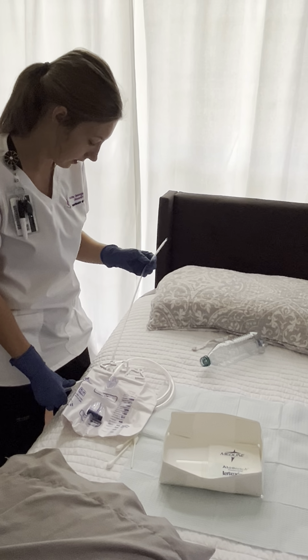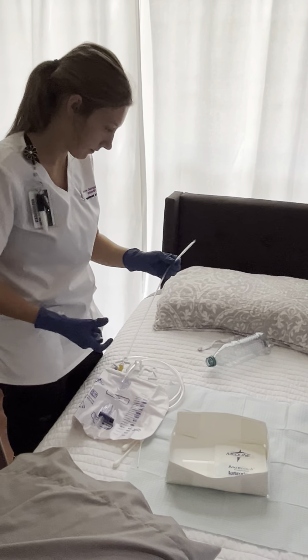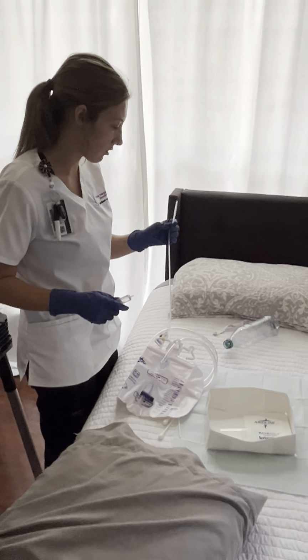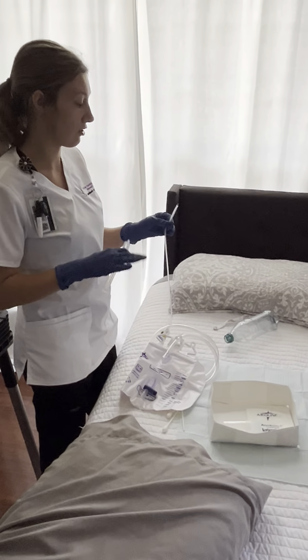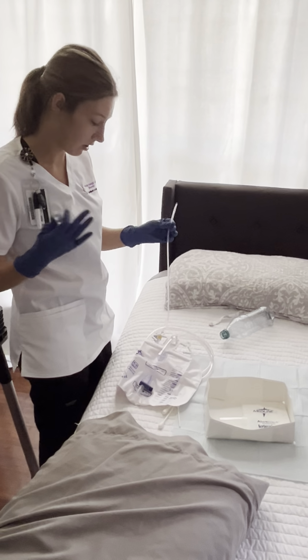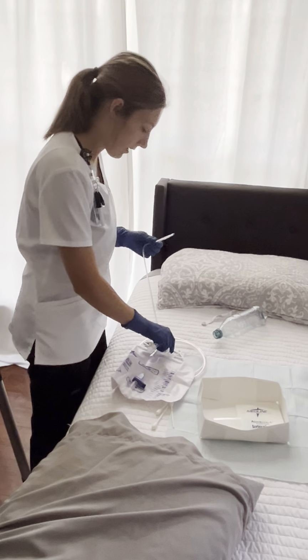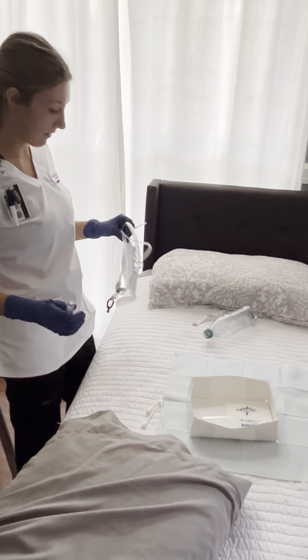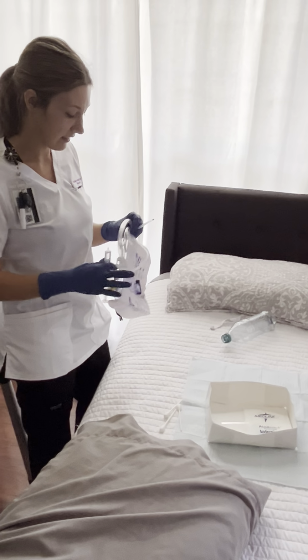Perfect. And I'm going to examine the end of the tip to make sure it's intact and to ensure that I see no pus or blood, and everything seems to look great.